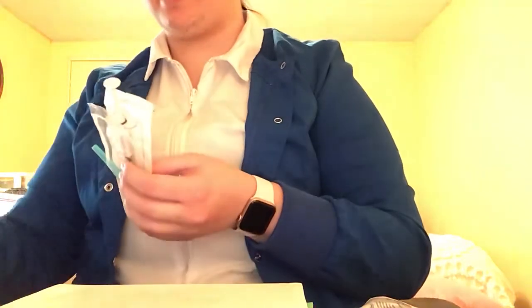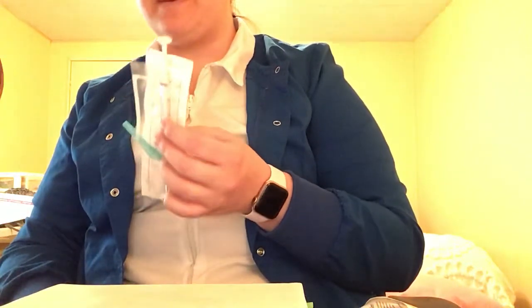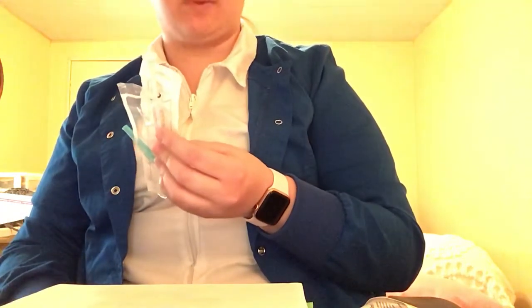And I would go ahead and perform my third set of rights with this medication. So this is the influenza vaccine for the person, Anna Powolowski, date of birth May 5th, 1957. Her allergy is penicillin, and her reaction is hives. It is to be given at 0.5 mLs for the amount. The route is intramuscular, and the time would be 16:20, which is right now.